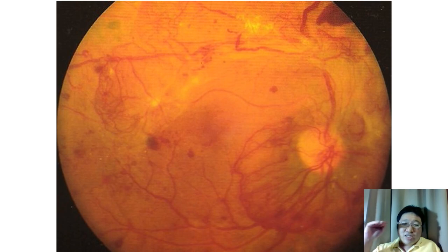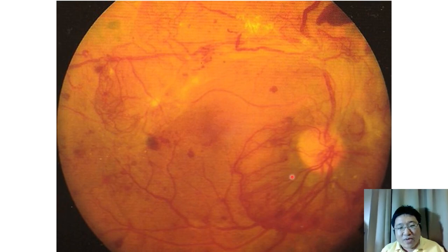If there is a neovascular membrane breaching the inner limiting membrane, that is the stage of proliferative diabetic retinopathy. So the cutting point is the limiting membrane. If there is new blood vessel growth that breaks the inner limiting membrane into the posterior hyaloid, forming a neovascular membrane on the surface of the retina, that is proliferative diabetic retinopathy. So here we see blood vessels coming out from the retina. So this is proliferative diabetic retinopathy.